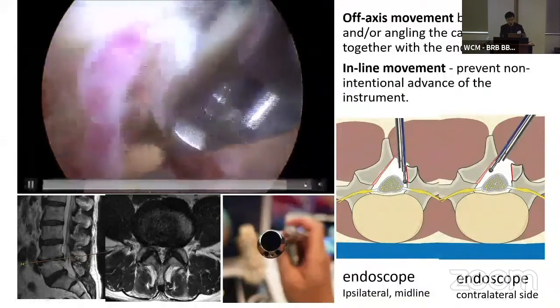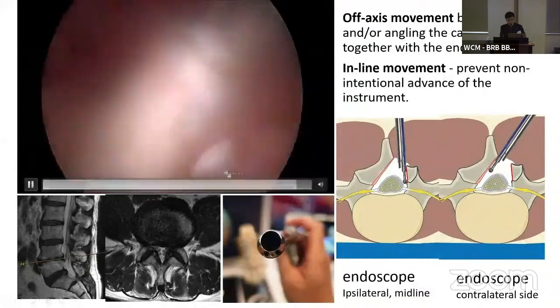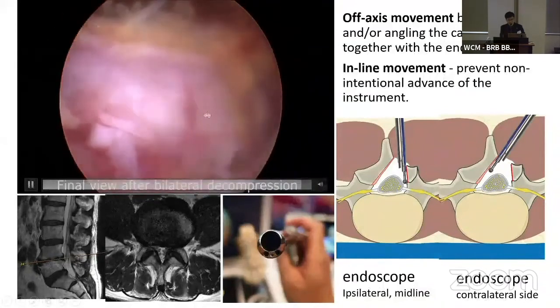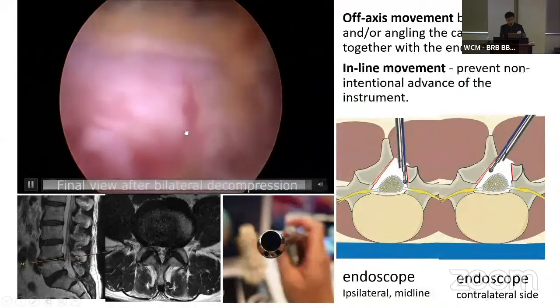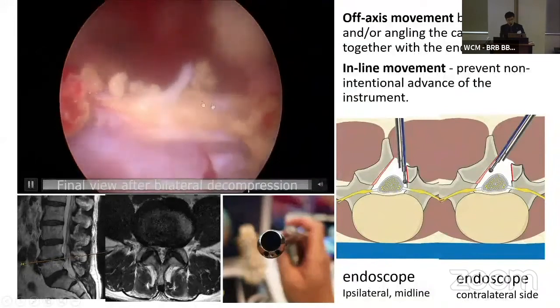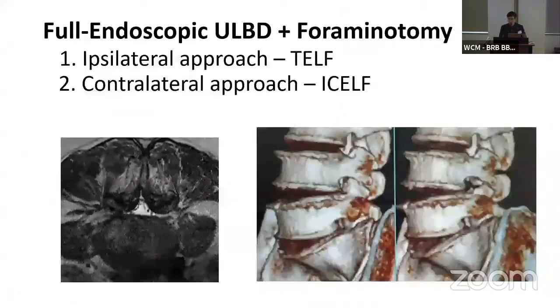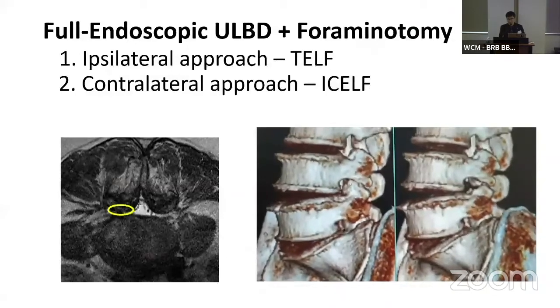Finally, we can decompress. This is removal of the ligamentum flavum by the envelope technique. We can see the decompressed traversing nerve, central canal, and contralateral side. Full endoscopic ULBD has much more power because the surgeon's eyes are already inside the spinal canal.